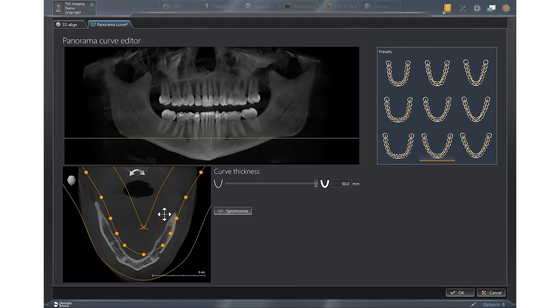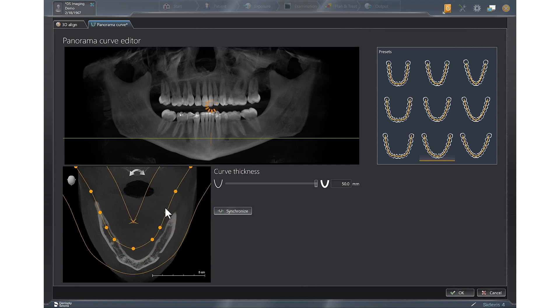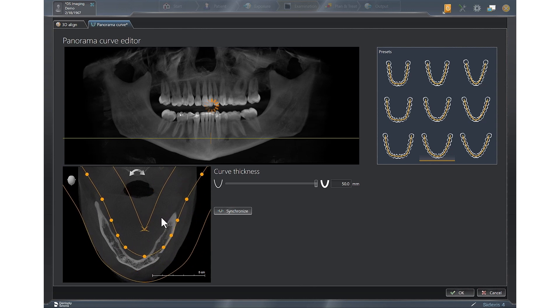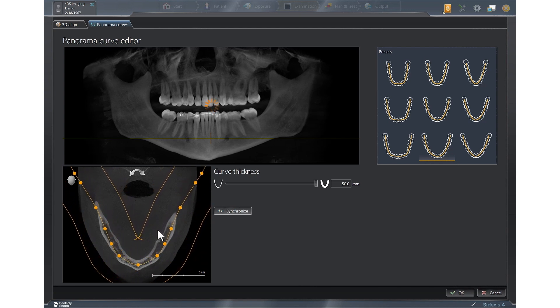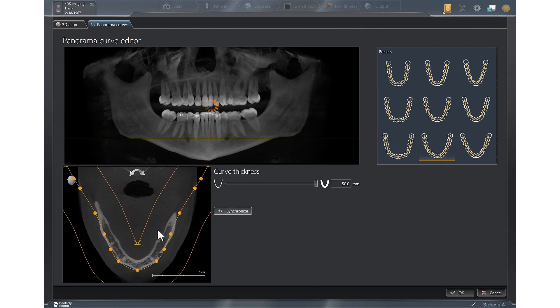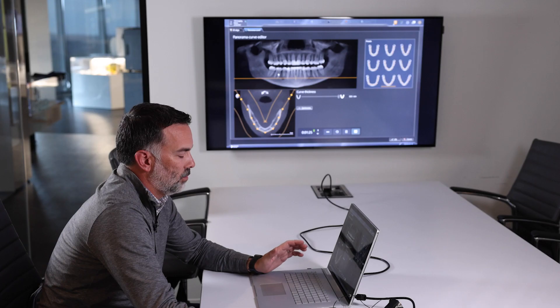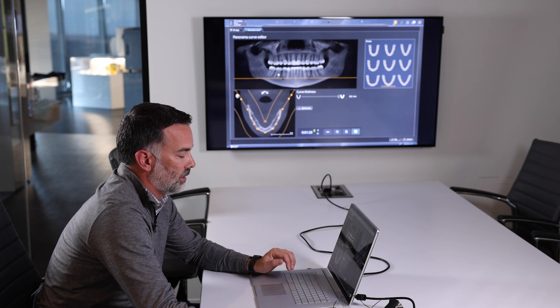We get the crosshairs — left click and hold — and you can see you can move the entire arch form around. Your best starting point is to get that center dot right to the tip of the bone and release. Once again you can see in the pan that will render into the image. From there it's subjective to the clinician's preferences.